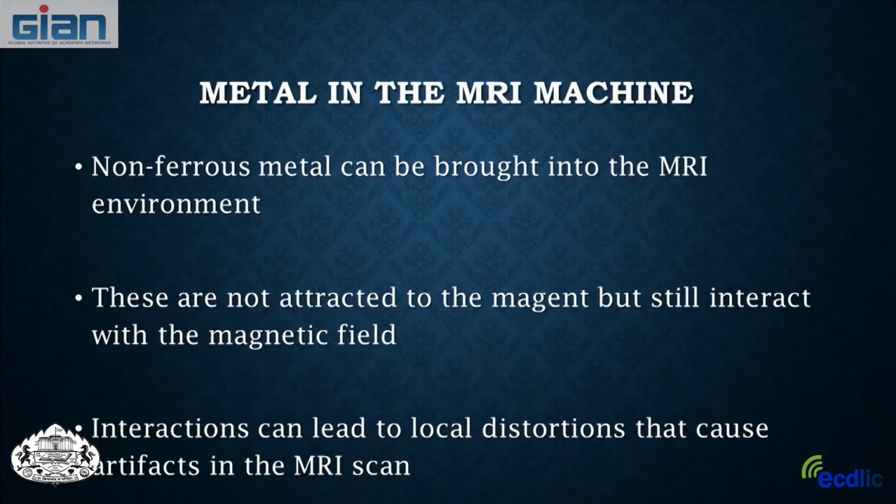Pardon me? Yes, that's a good point. So, yes, fillings. Okay, so fillings, this is a very good point. We always ask about fillings and metal in the mouth.